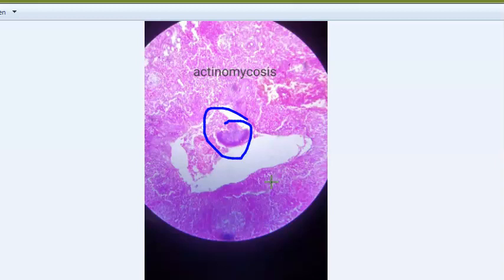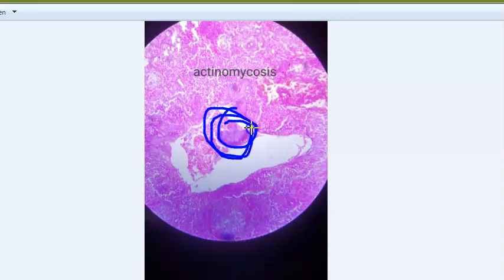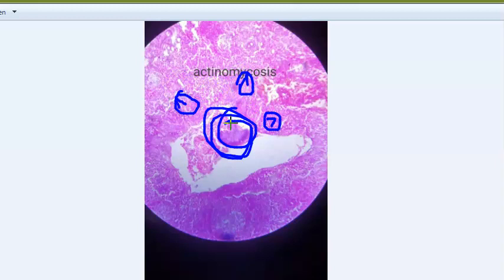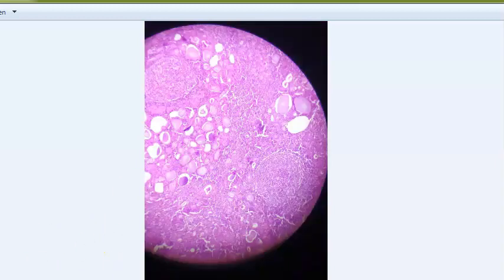Types of actinomycosis include abdominal, pelvic, thoracic, and cervicofacial - with cervicofacial being the most common. The inflammatory reaction shows central suppuration. The center of the lesion shows abscess, and at the periphery you see chronic inflammatory cells. The central suppurative area contains bacterial colonies with bluish-stained mycelium and peripheral eosinophilic material - this is the Splendore-Hoeppli phenomenon. There will be numerous neutrophils because it is a bacterial infection.